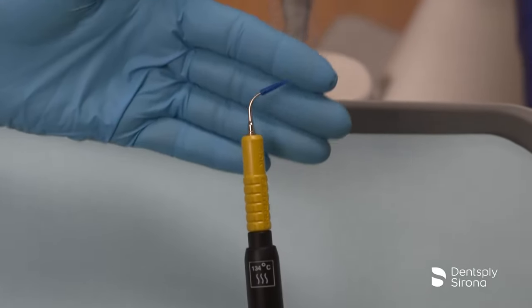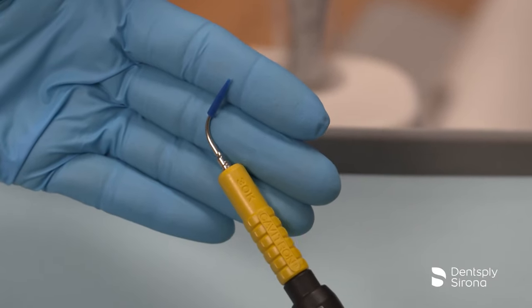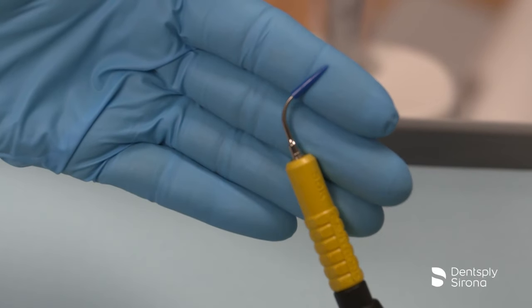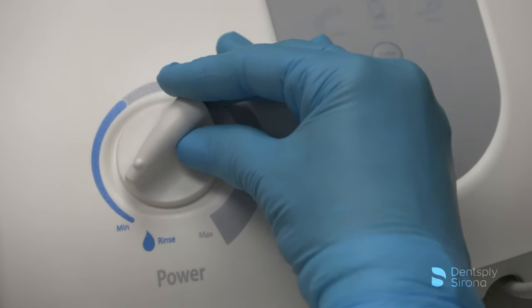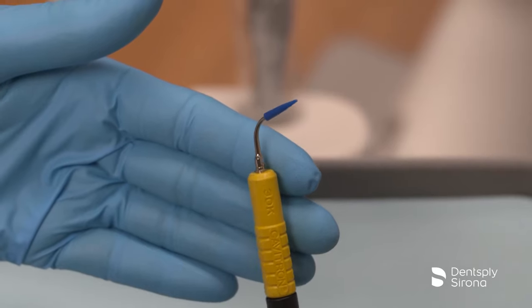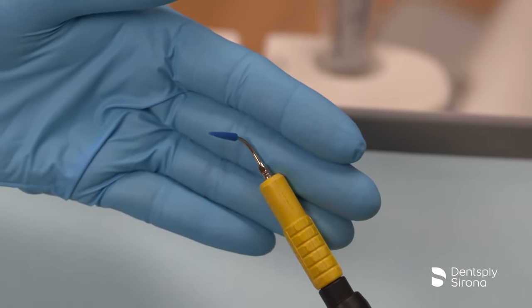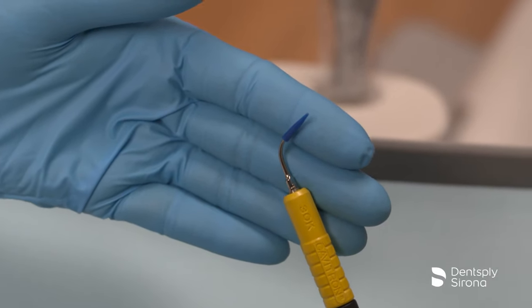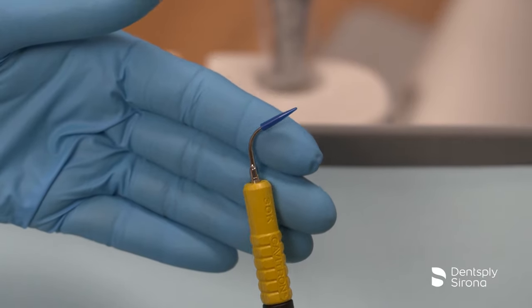This is the Cavitron Soft Tip Ultrasonic Implant Scaler. This insert gently removes light to moderate plaque and calculus without damaging implant titanium abutment surfaces and should only be used at low power level. The implant insert is manufactured and designed to be utilized with the corresponding Soft Tip Disposable Profi-Tip, which is removable for one-time use and may not be used on any other insert.